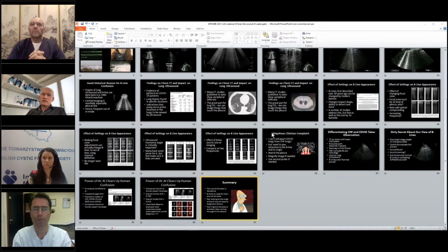I have shown you in granulomatous subpleural consolidations like Wegener's granulomatosis, sarcoidosis, you can see enhancement of the entire subpleural consolidation. So whenever you are in doubt, you'd like to better understand the pathophysiological processes behind, then you should use it.